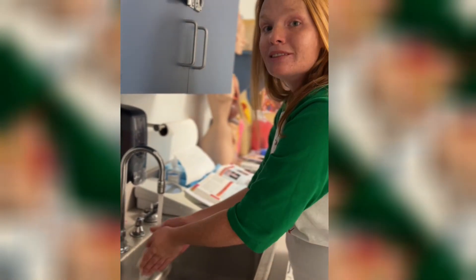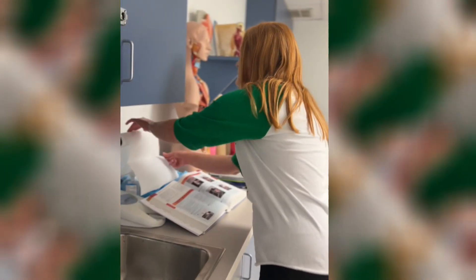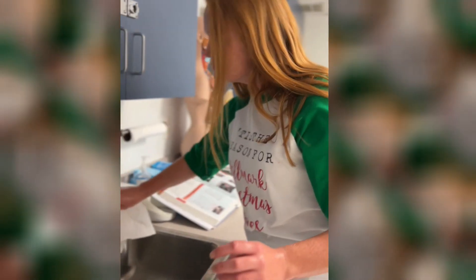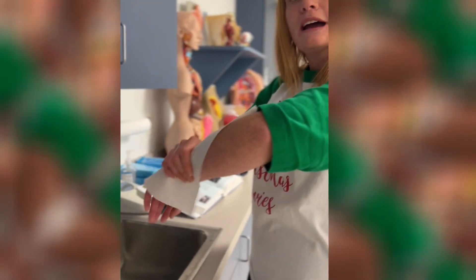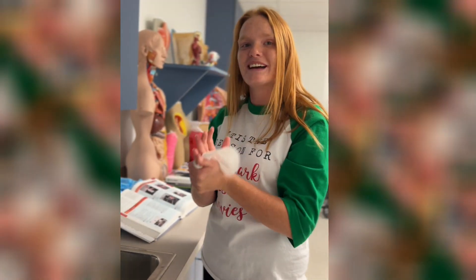Leave the water running because you don't want to recontaminate your hands. Grab a paper towel and use it to turn the water off, then set that towel aside to throw away. Grab another paper towel to dry your hands. And that is how you properly wash your hands.